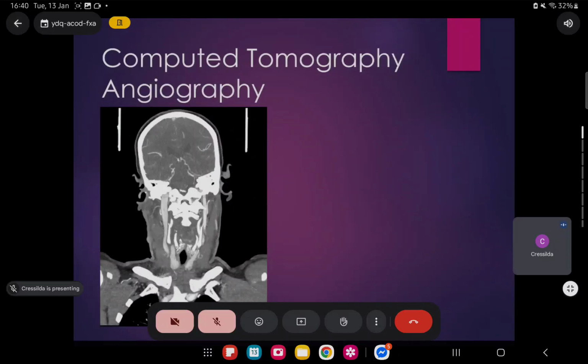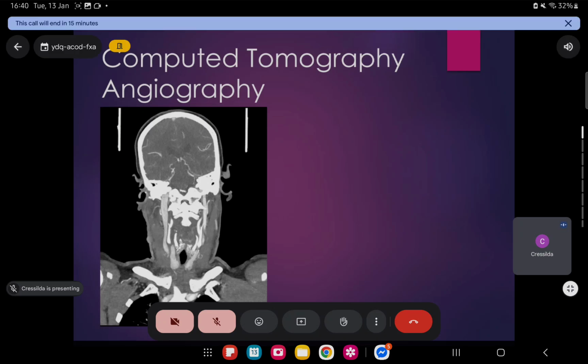Overreaching, when we talk about angiography, this is also something else that we can do with CT: you would have optimal enhancement of the arteries with little to no venous component, so purely arteries only. The technical aspect of the examination will vary from one institution to another. So, a normal CTA of the carotid and vertebrobasilar arteries, that's the image that you see.